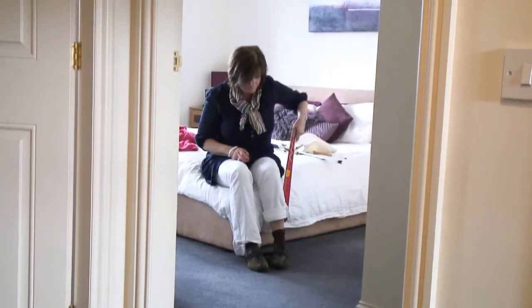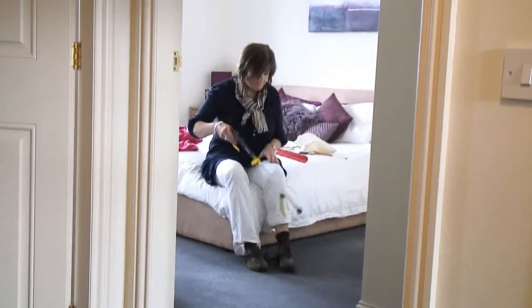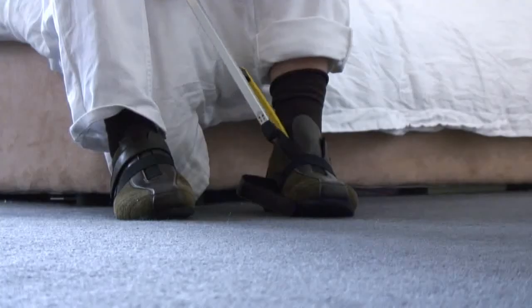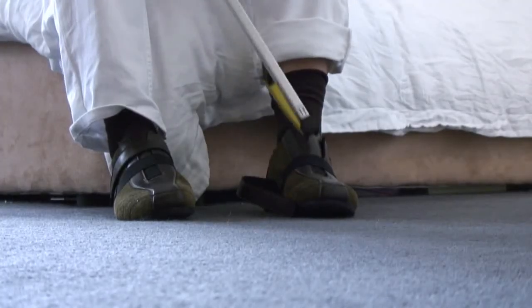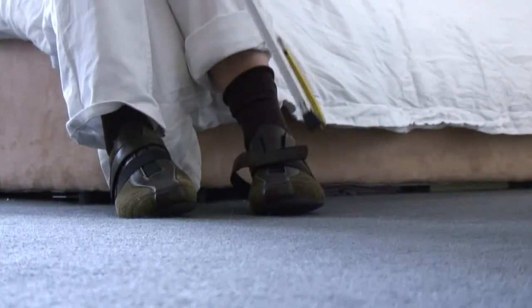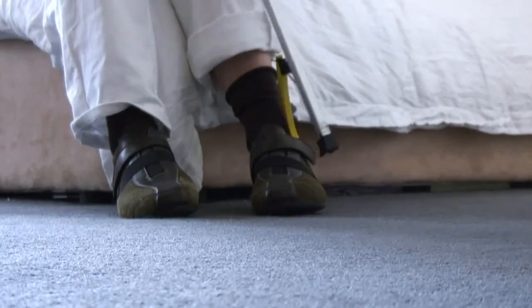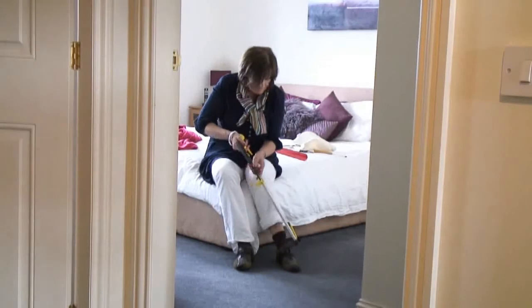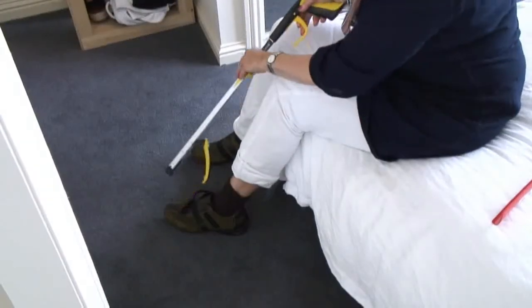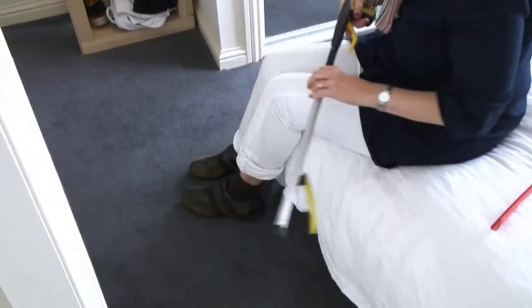Now these shoes have velcro on them, so what you can use is a thing called an easy reach. This has lots of different uses, but it can certainly be helpful for a number of aspects of getting dressed, and one of those is fastening the straps on velcro shoes. Just catch the end and push that across and that's now firmly attached. Also available if you have lace-up shoes, you can get elastic laces, which would basically turn your shoes into slip-ons. You could use your long-handled shoe horn and that takes out the need to bend down to tie your laces.